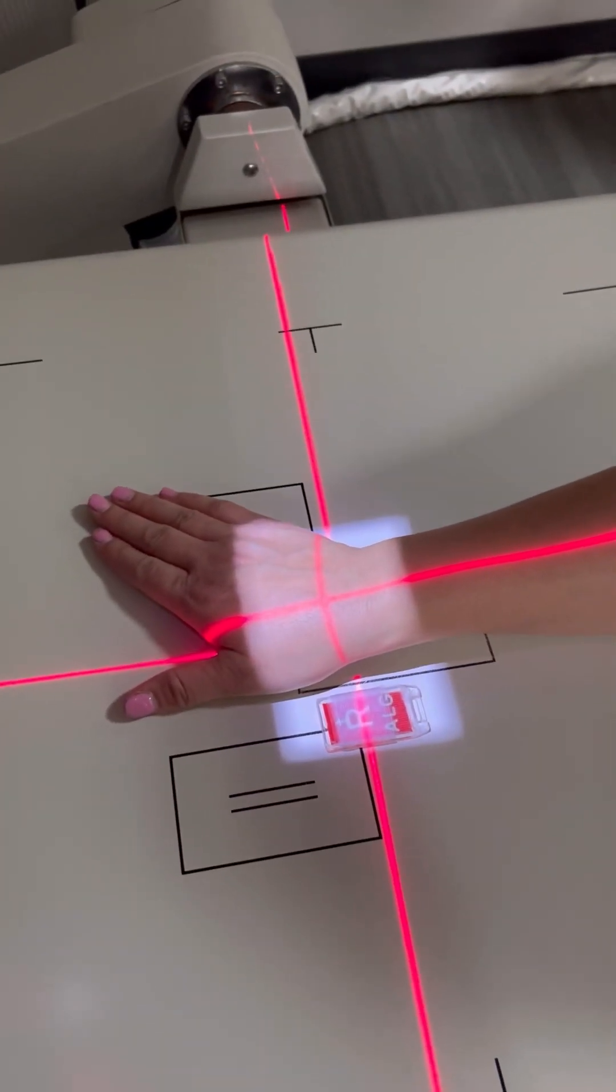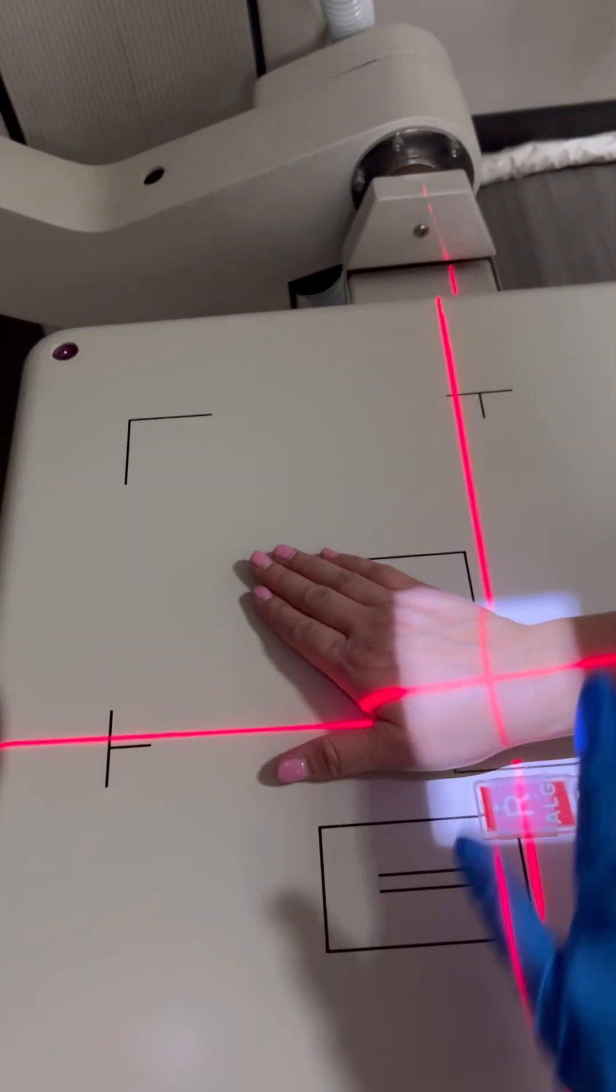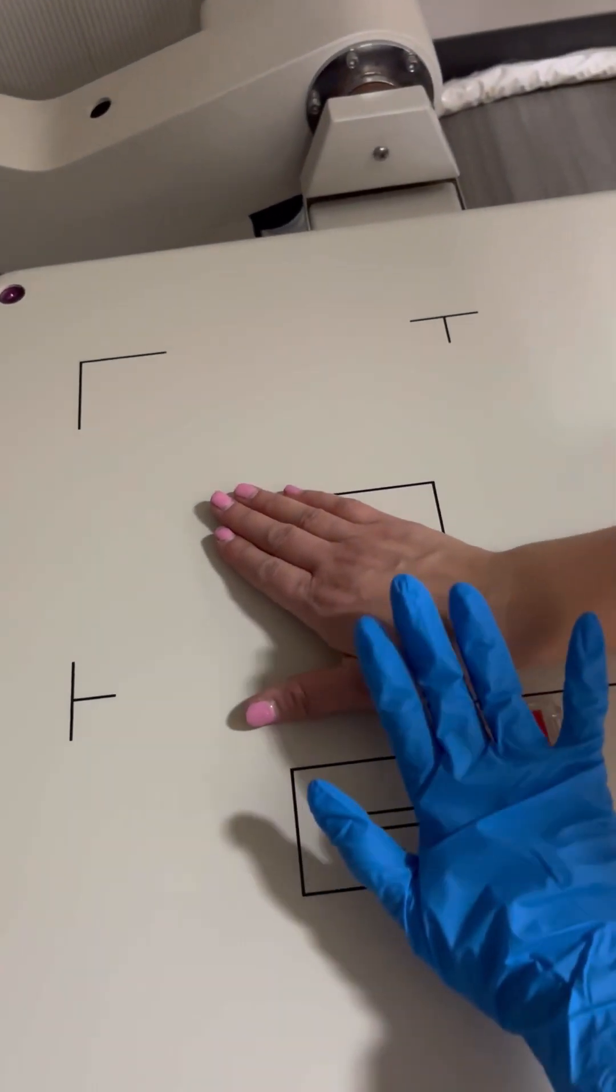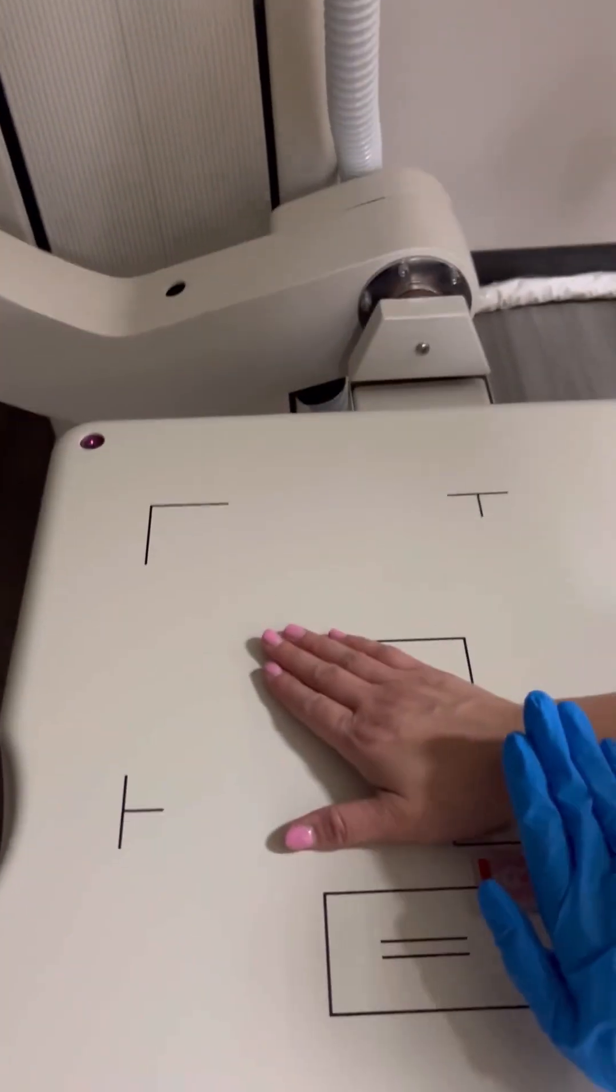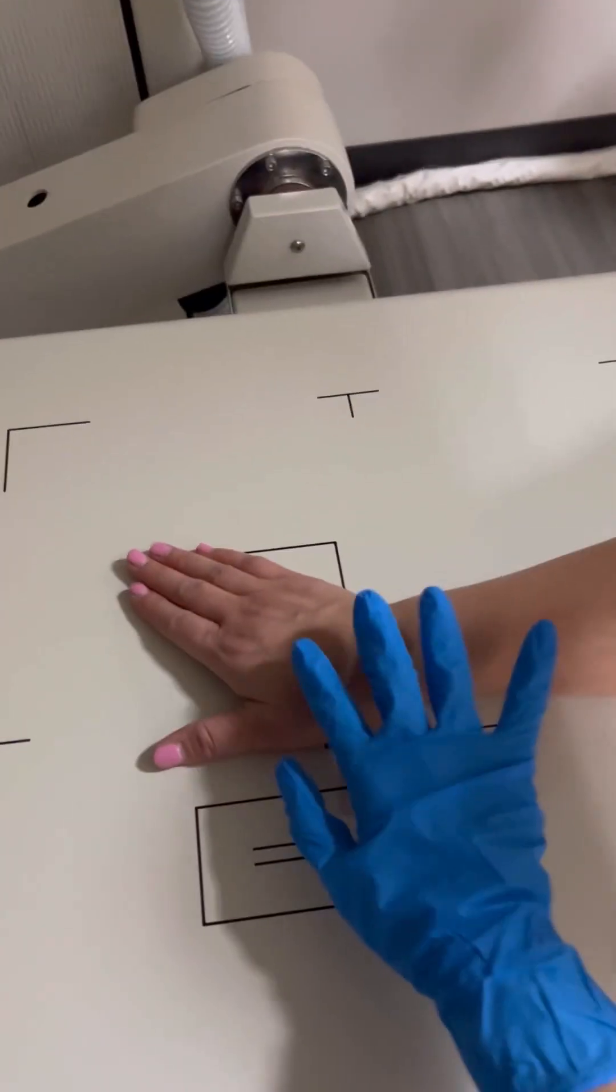You can put your marker right there, but you're going to get the same relationship between the X-ray beam and the patient anatomy.